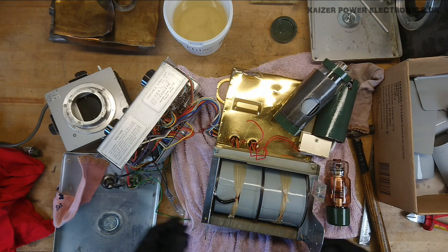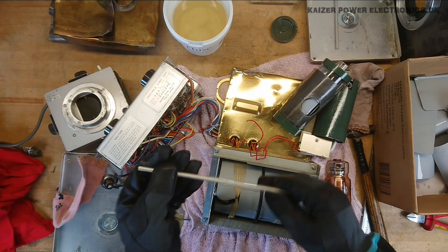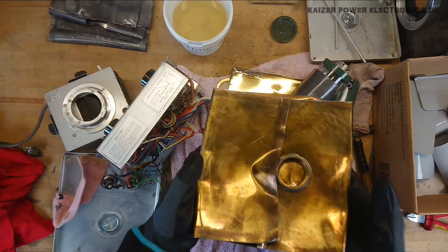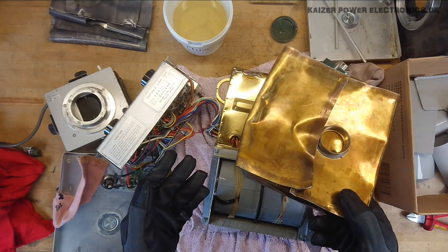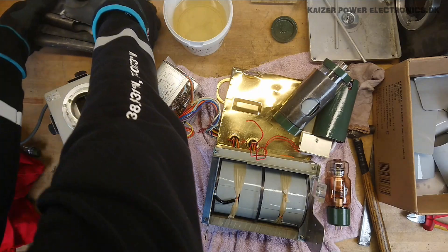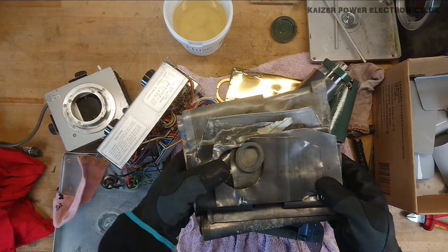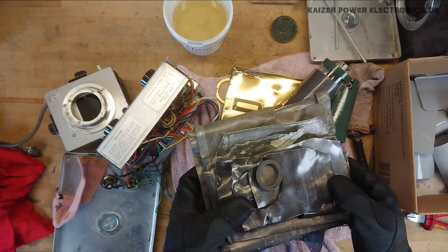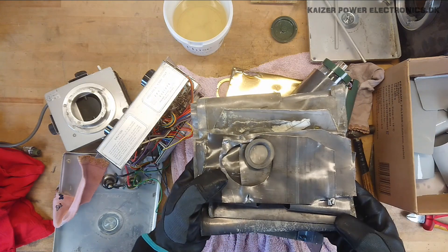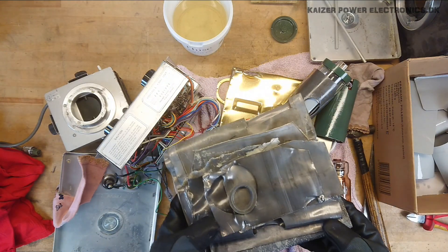So a quick recap of what I got out of taking this apart: some nice threaded long rods from the enclosure. I would say around one to two kilograms of brass that just goes to recycling. And for the lead, I would say maybe two to four kilograms of lead shielding. Some of it is very nice big pieces, so I'm going to keep that, whereas the smaller cut-out parts go to scrap.